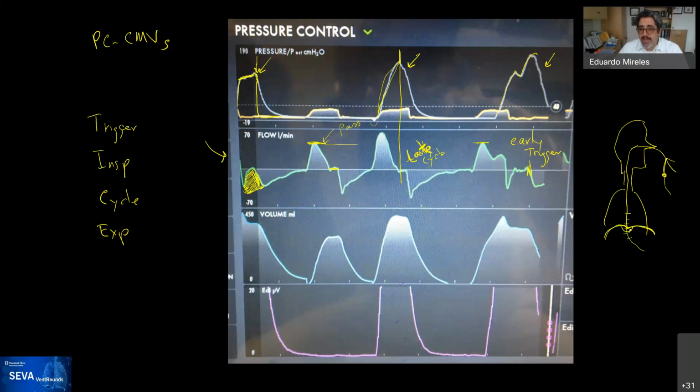The crura of the diaphragm is where it meets and anchors itself to the thoracic and lumbar spine, and the catheter goes through the hole with the esophagus, so it can measure the activation, the EMG, of the diaphragm.